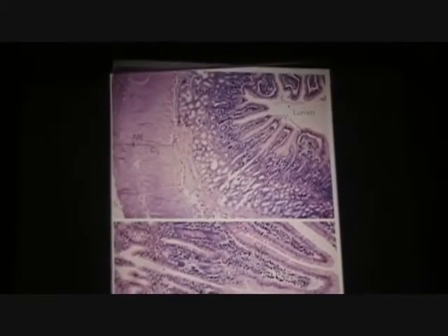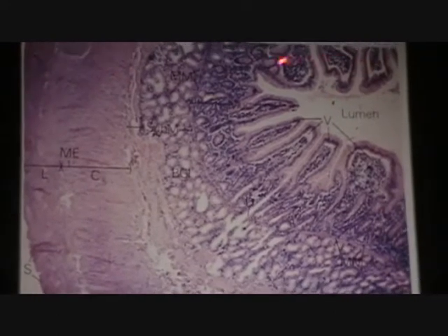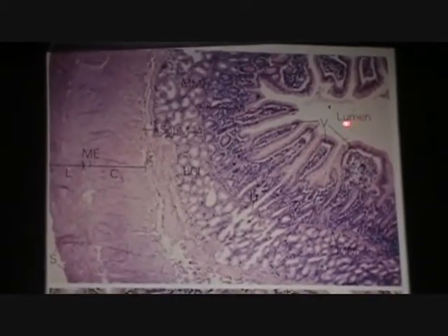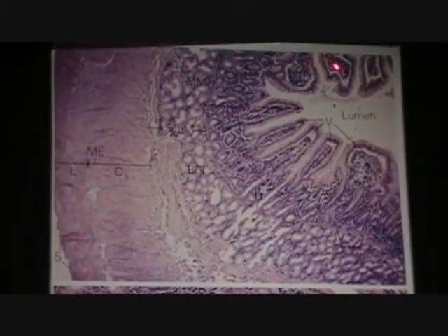Okay, then on we go through the pyloric sphincter into the small bowel, most noted by the little fingers that you see sticking up into the lumen. So the villi instantly tell you you're in the small intestine.